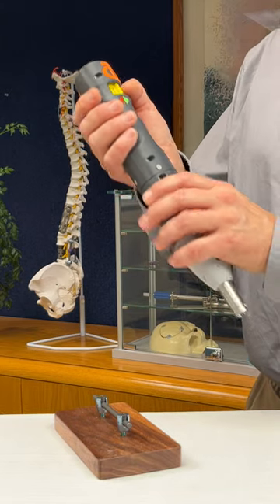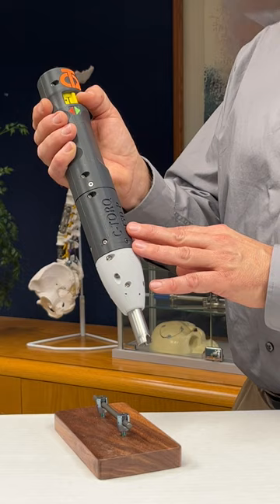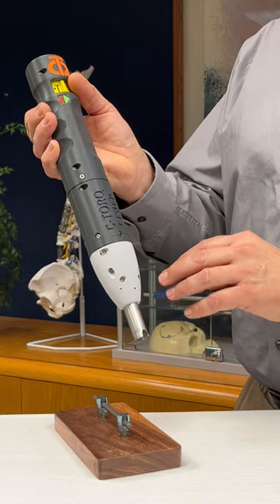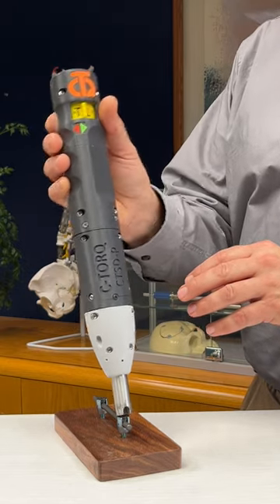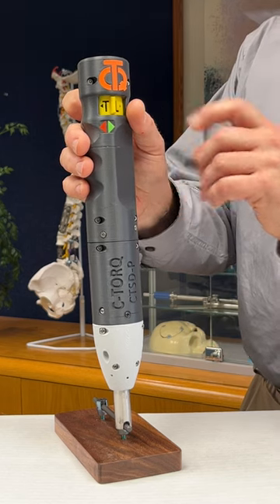This same counter-torque technology has been integrated into a battery-operated counter-torque screwdriver. This single-handed instrument is used by the surgeon by simply placing it onto the pedicle screw and set screw to apply the tightening torque.